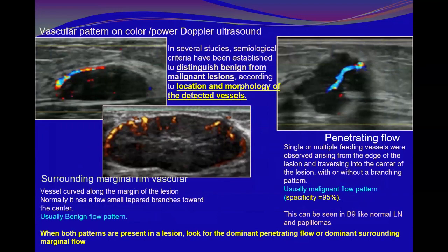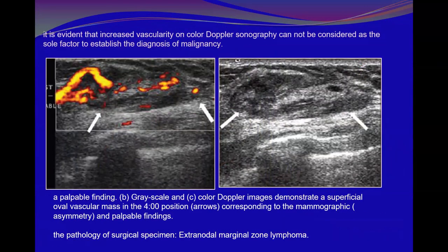It looks like a lymph node, right? Even on grayscale you can see a hilum in the middle, resembling a lymph node. Yes, but it is also more impressive of hamartoma. You see, here it is more elongated. Yes, I agree with you.